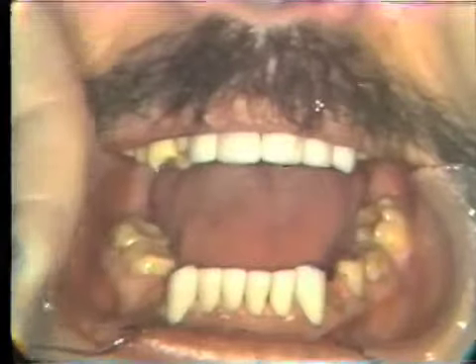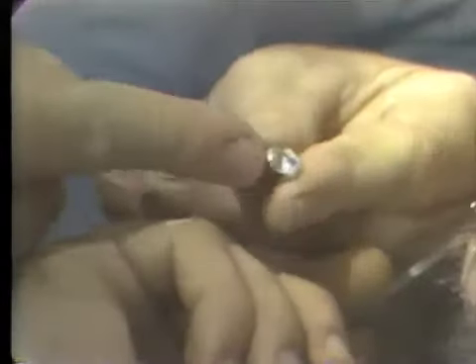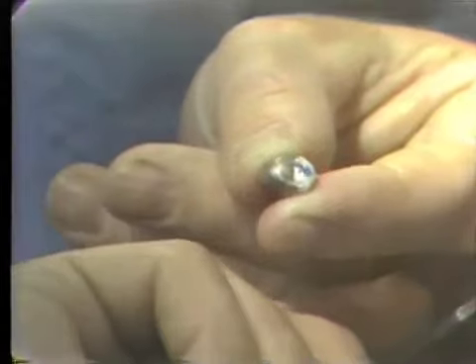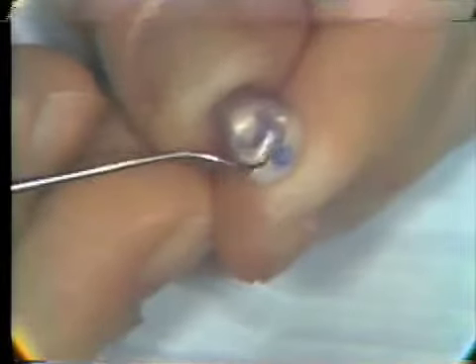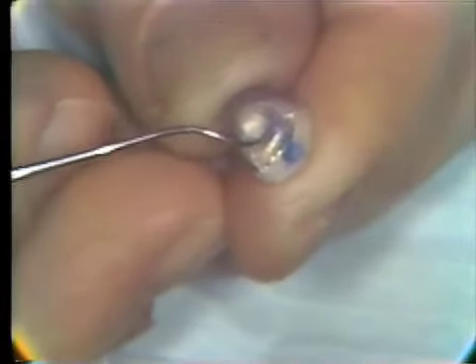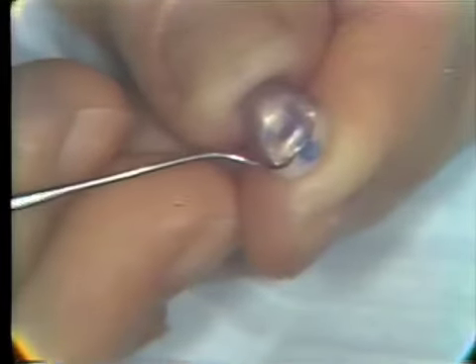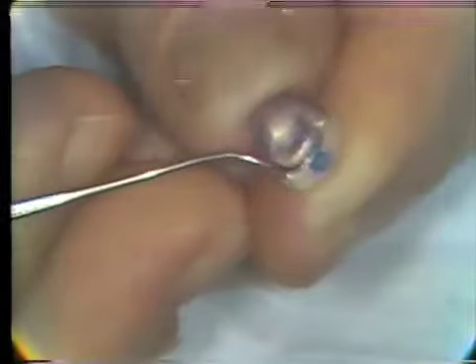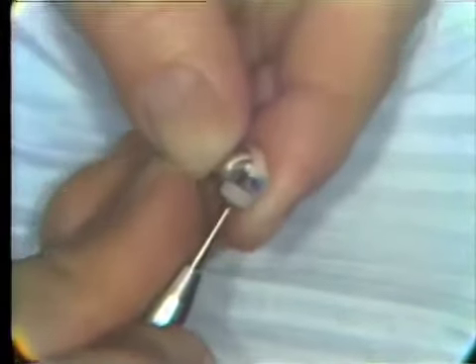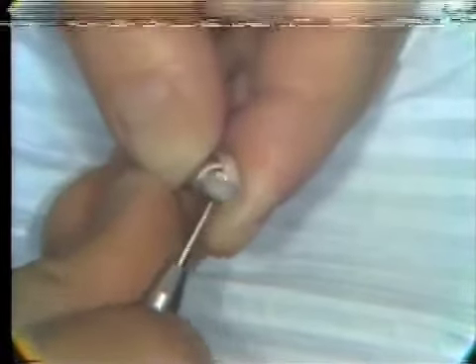We've got the steepness of our incisal guidance established from the articulator in our study cast. We now want to adjust the concavity, the lingual concavity, on the restoration. As we see here, of where the guidance is coming, we're coming across the gold here into the porcelain. We have our centric stop, or our supporting stop here, and we want a nice, gentle concavity as we come out to the cusp tip. This gives us our slow guidance, or our lingual concavity for our guidance. So we will adjust that guidance so that we have a nice, smooth movement. And this is the thing you want to check in the mouth, is to see if the patient can move smoothly on these guidance areas.